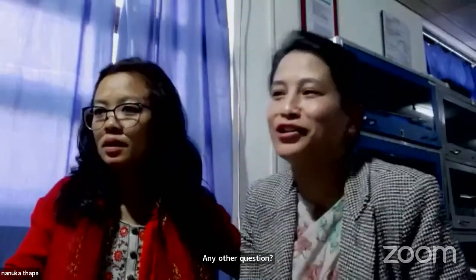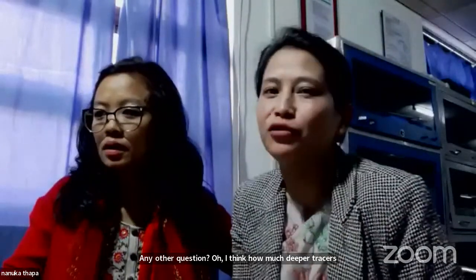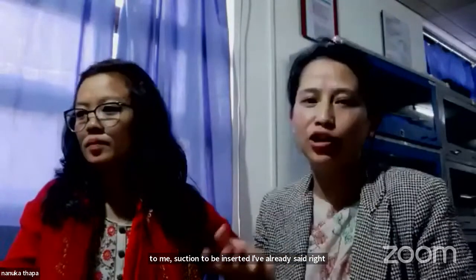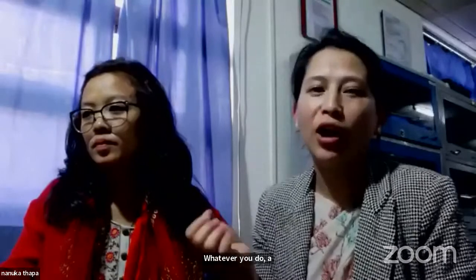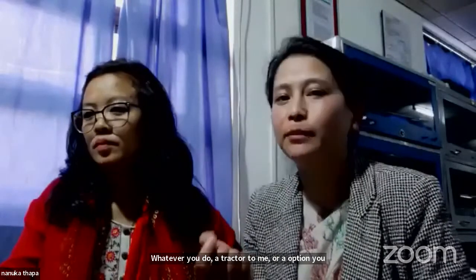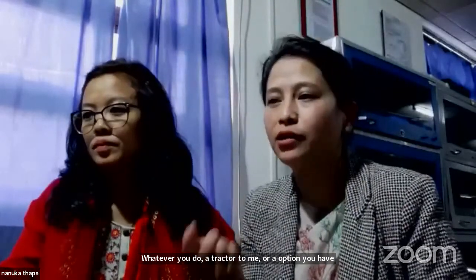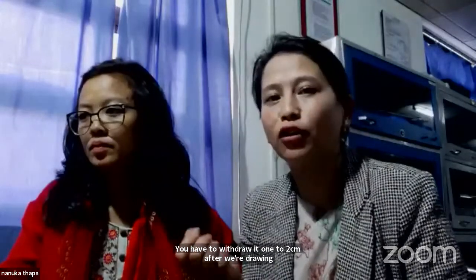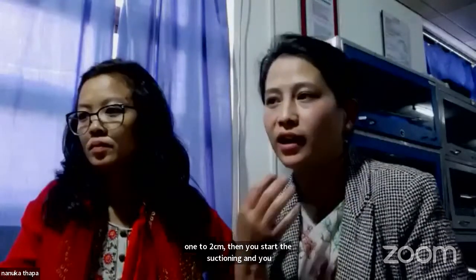How deep should the tracheostomy suction be inserted? I've already said, whenever you do a tracheostomy or ETT suction, you have to insert the catheter till the point of resistance. Once you've reached the point of resistance, you have to withdraw it 1 to 2 centimeters. After withdrawing 1 to 2 centimeters, you start the suctioning and take out the suction catheter, that also in a rotatory motion.